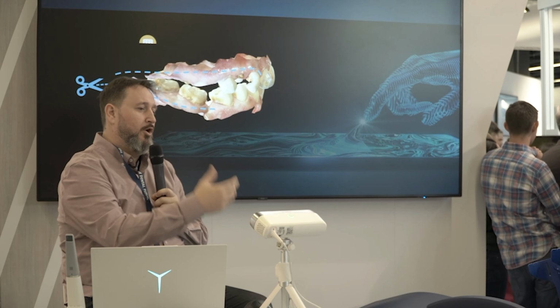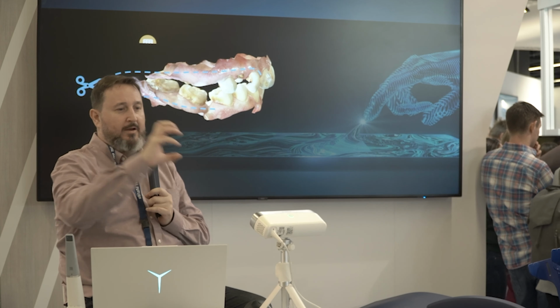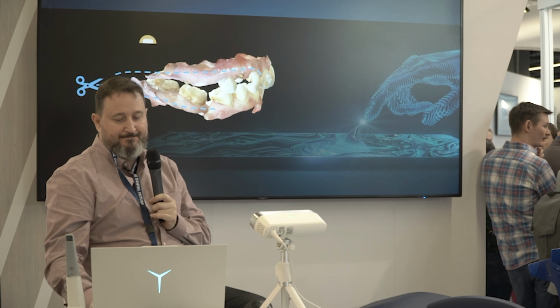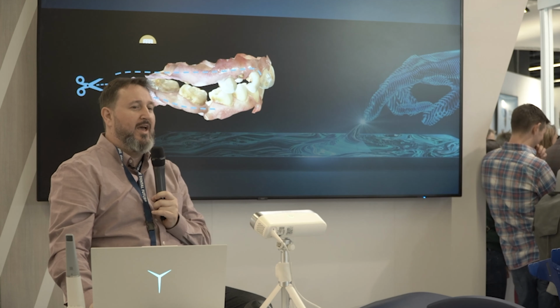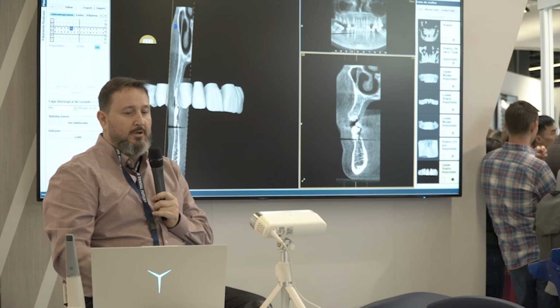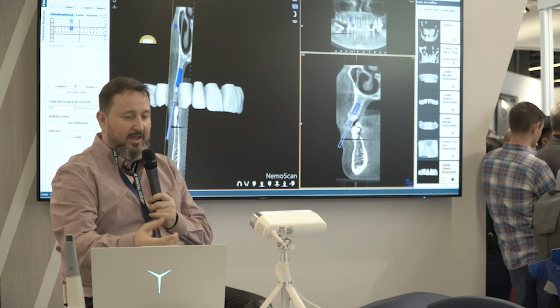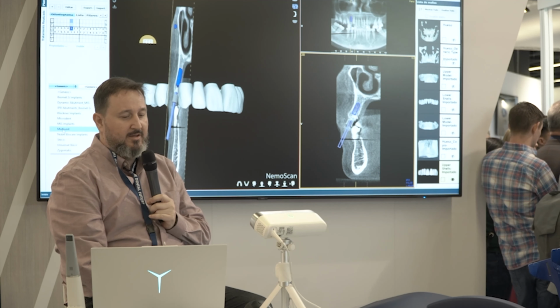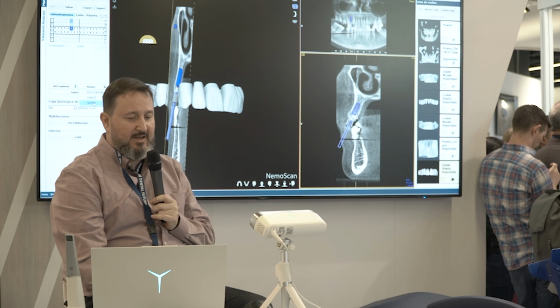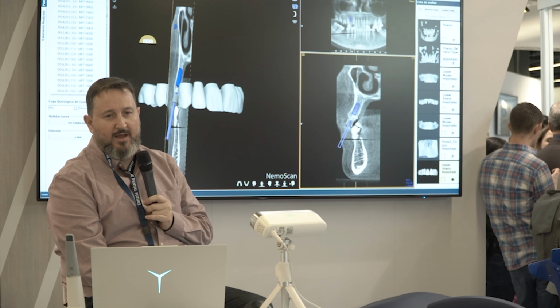With this result, we will go with the patient and we will discuss it. We will go with our teamwork and we will discuss it. And now we'll go to the surgeon. Once in the surgery, we decide we have to make a reduction of bone. So with the doctor, I plan the treatment, and here you can see that we create the implant positioning. In this case, as it is a very difficult case, we won't use a surgical guide as such.